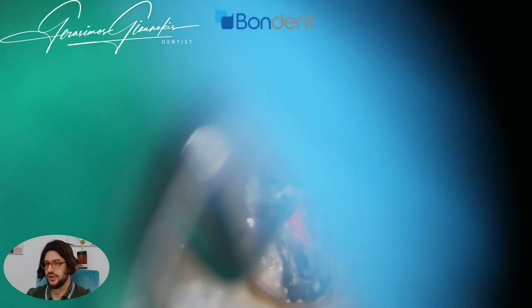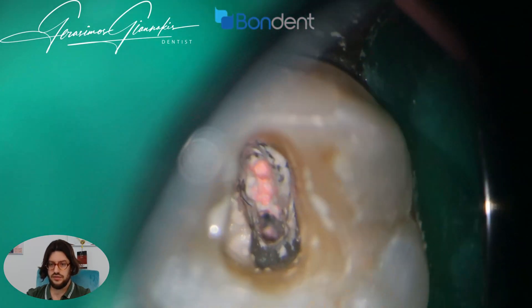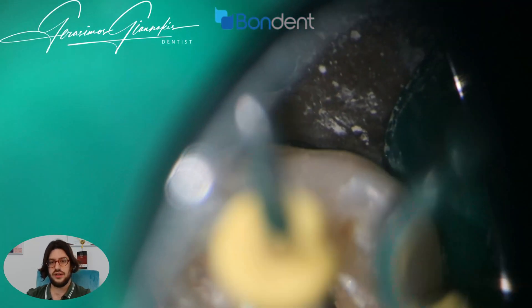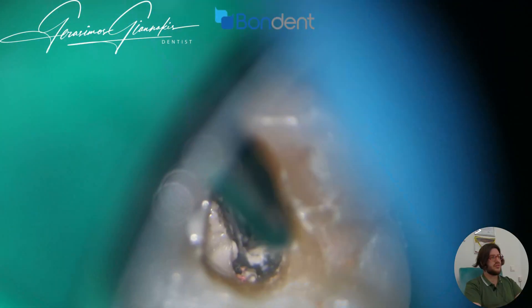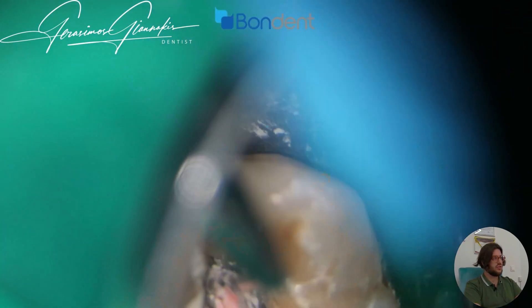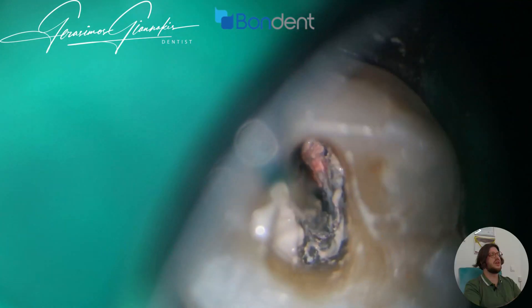It is very important to remove all the excess endodontic materials so that we can have a clean cavity for the restorative procedure. In the next appointment I use alcohol with a micro brush to remove the excess of sealer and material — be very patient and careful, because all this material can be under undercuts and in areas not visible with direct vision.